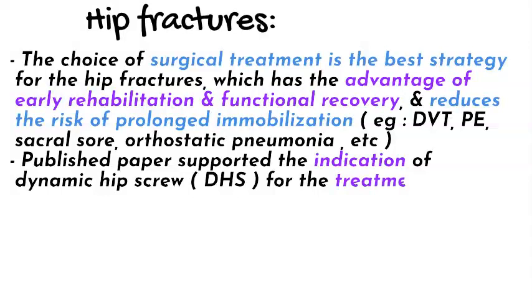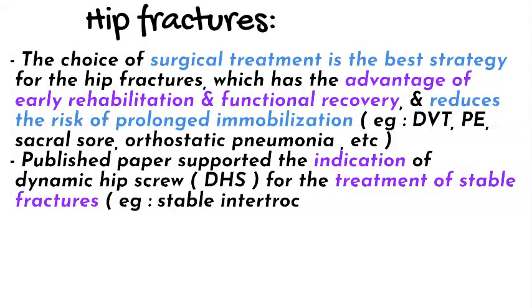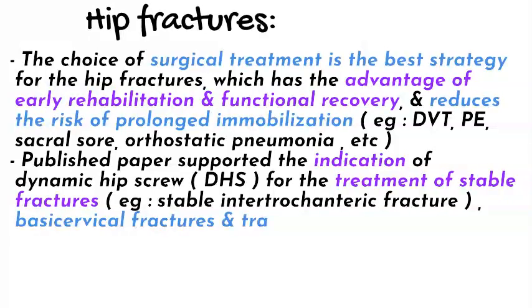Published papers supported the indication of dynamic hip screw DHS for the treatment of stable fracture. Example, stable intertrochanteric fracture, basicervical fractures, and transcervical fractures.